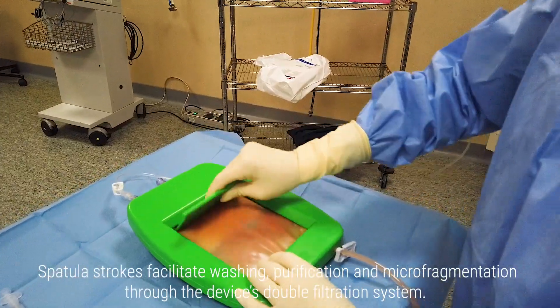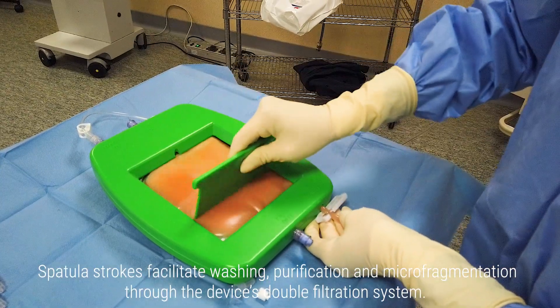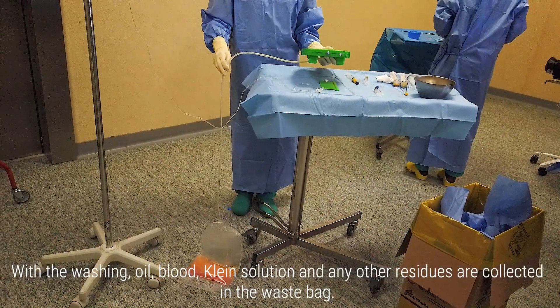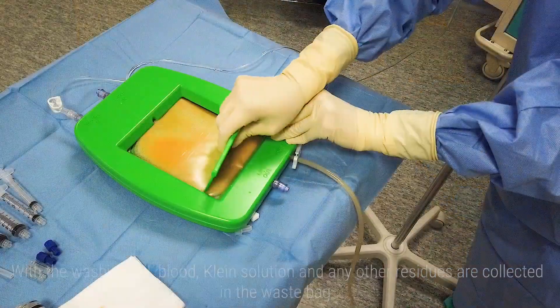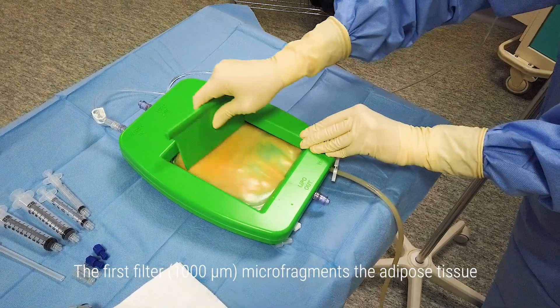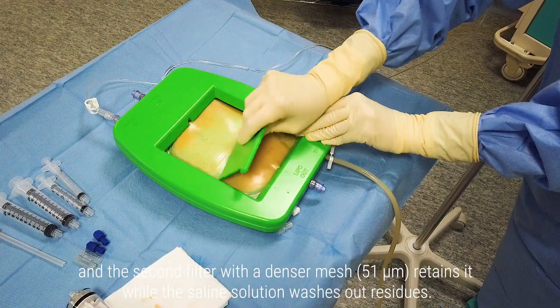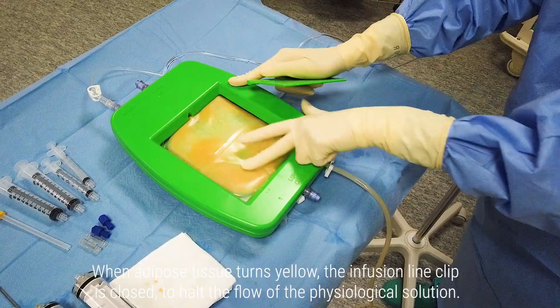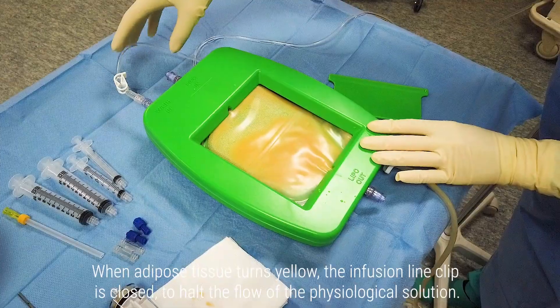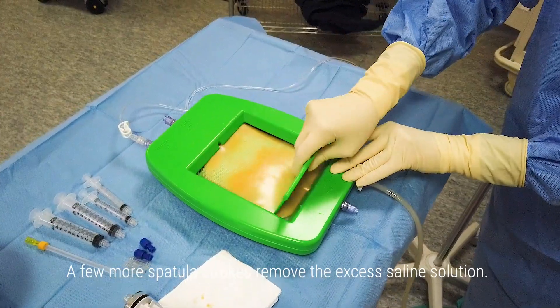Spatula strokes facilitate washing, purification and micro-fragmentation through the device's double filtration system. With the washing, oil, blood, Klein solution and any other residues are collected in the waste bag. The first filter at 1000 microns micro-fragments the adipose tissue, and the second filter with a denser mesh at 51 microns retains it while the saline solution washes out residues. When adipose tissue turns yellow, the infusion line clip is closed to halt the flow of the physiological solution. A few more spatula strokes remove the excess saline solution.